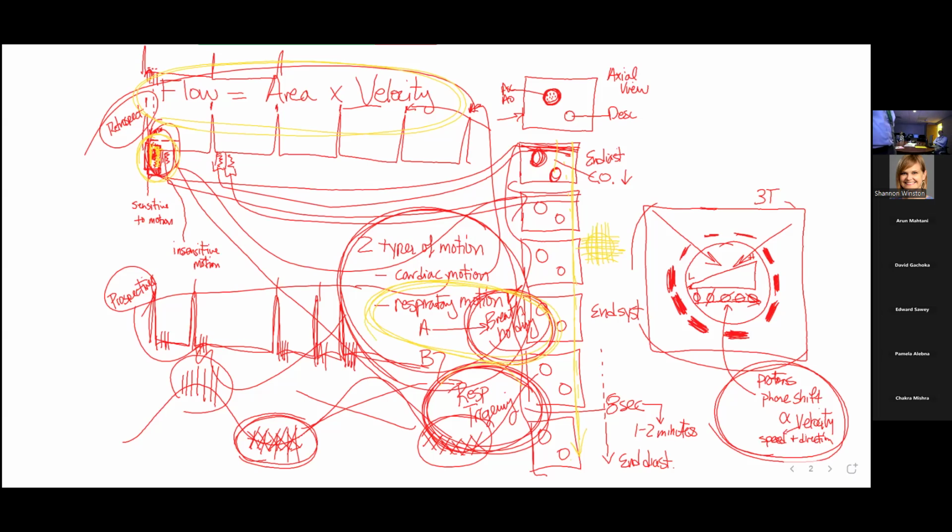Another technique, which we did not talk about last week, because we weren't that interested in it with just the cine imaging, is we can use respiratory triggering. And remember, you're going to capture at some component of the respiratory cycle, and the image acquisition is going to take longer. Now, the patient's not going to hold their breath, but it's going to take 1 to 2 minutes. Next slide.